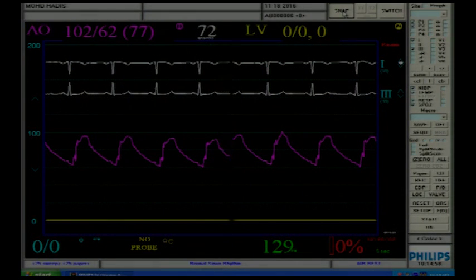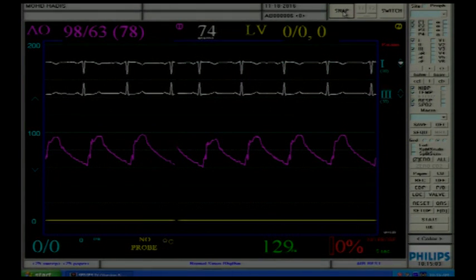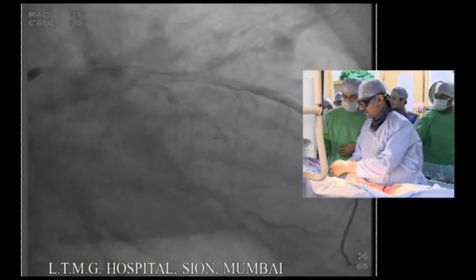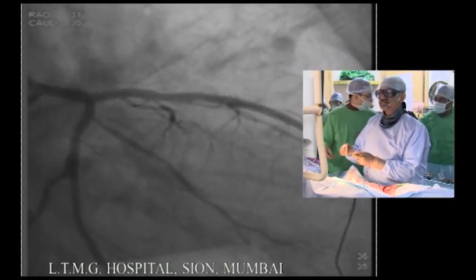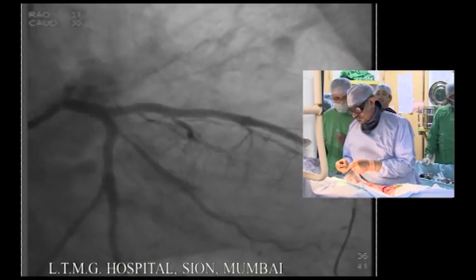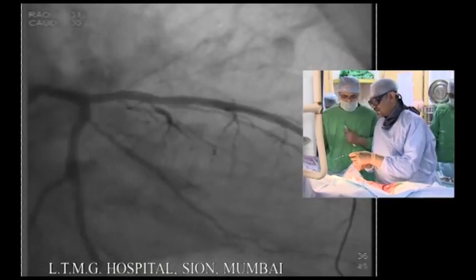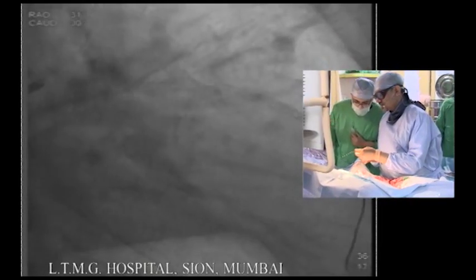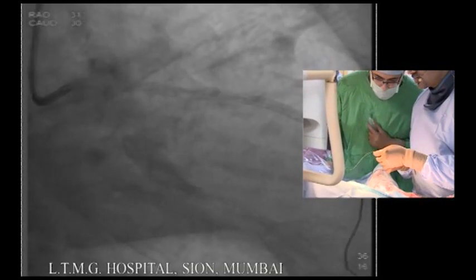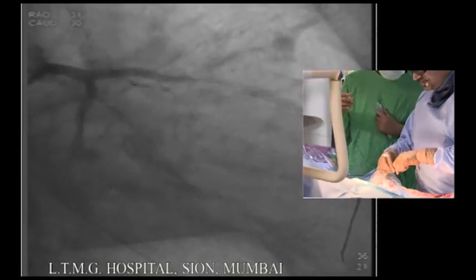I would suggest that you do a bit longer OCT pullback if you are doing it again, so you can see the whole stent with a longer pullback. Ajay, the recommendation is to go distal beyond the stent with OCT. I'm planning 2 pullbacks only. I think that in the machine you can also choose 50 millimeters or 75 millimeters. So maybe a 75 millimeter pullback.